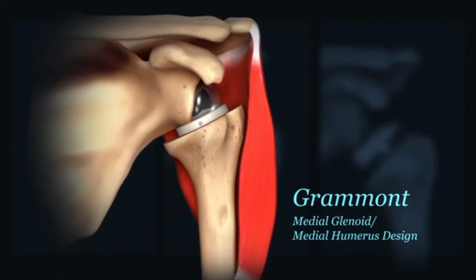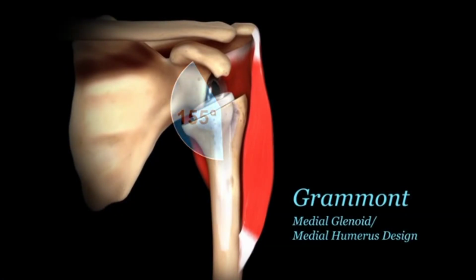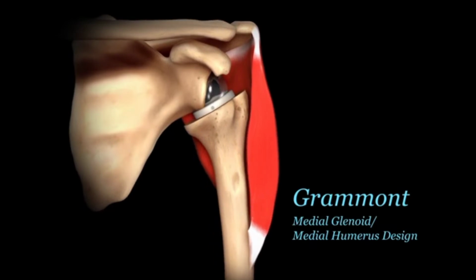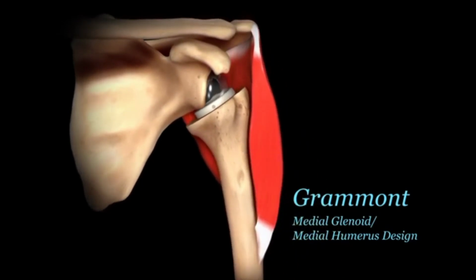The Grammont humeral prosthesis has a 155-degree humeral neck angle and is placed within the humerus, causing it to shift medially and be placed directly inferior to the glenosphere, which elongates the deltoid but shortens the rotator cuff. This implant design and resulting humeral positioning is effective at restoring active abduction and forward flexion, but is less effective at restoring active rotation.